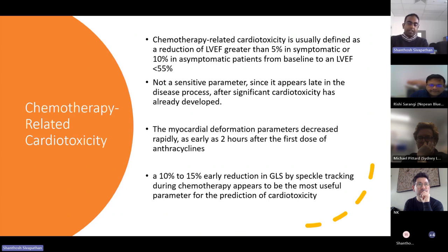Yeah, 100%. And again, it's very important that the strain is done correctly. Usually there are oncology clinics where the sonographers do strain day in and day out, and they're really good at what they do, and that's where high volume centers are really important. Yeah, cardio-oncologist, right?